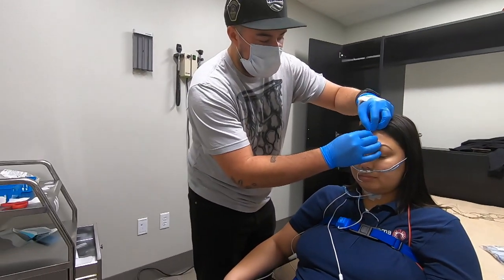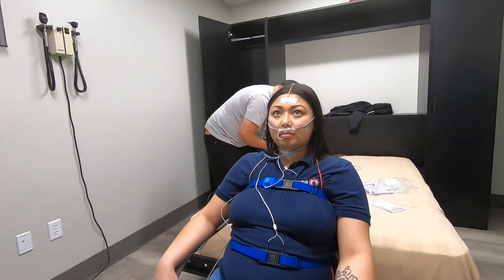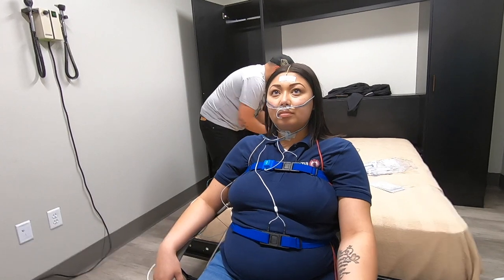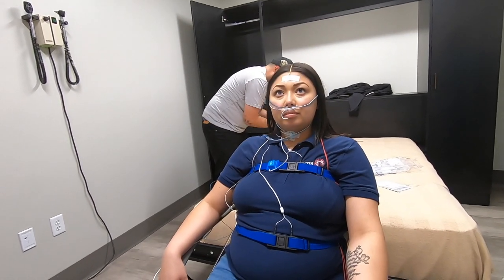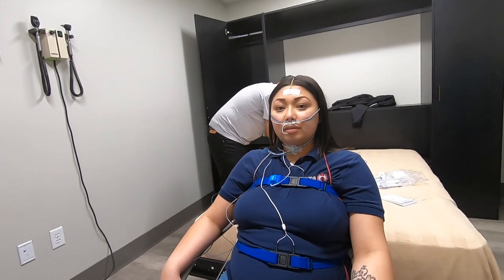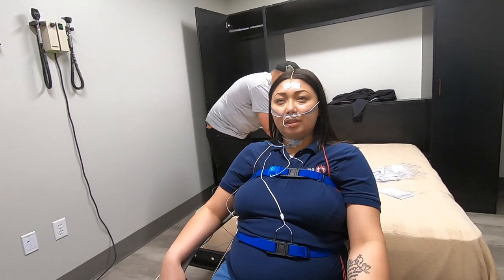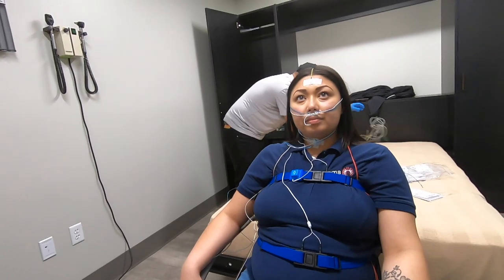We have a lot of electrodes already on, but Ray is putting on the ground. The ground is right there in the center of the forehead. The purpose of it is really nothing other than eliminating 50 and 60 cycle artifact — that's the artifact you'll see with a lot of electrical equipment. It causes really fast speeding and causes the lines to be way too thick and unreadable.